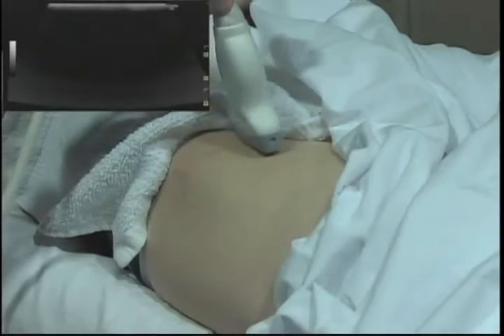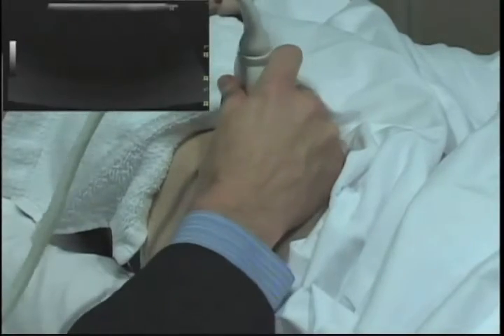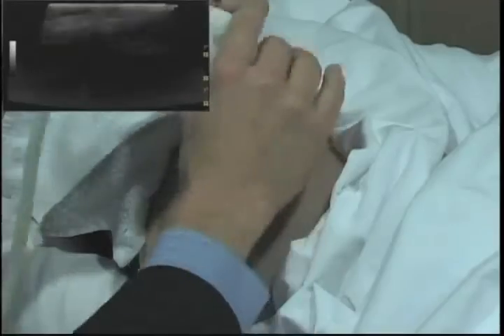a needle. So I'm going to start long axis, which is going to be sagittal oblique, which is parallel to the femoral neck. Distal will be to the right side of the screen.